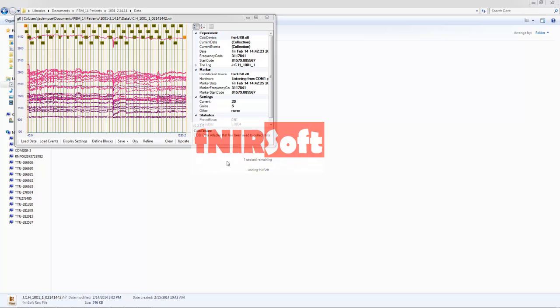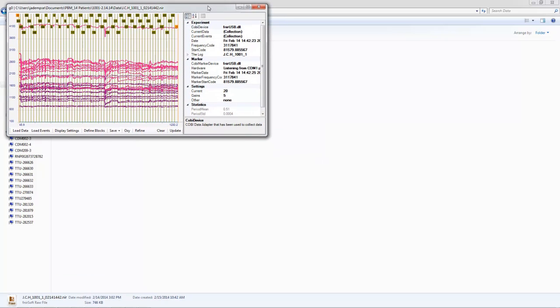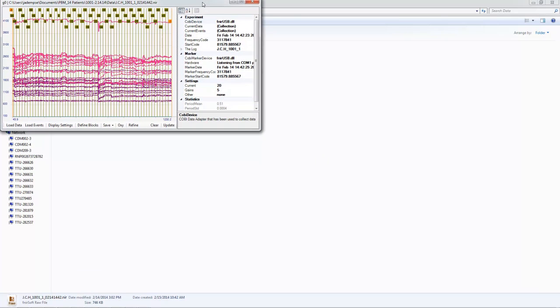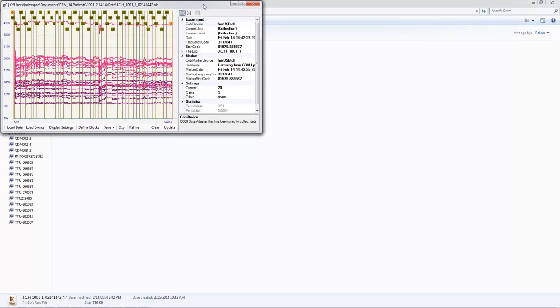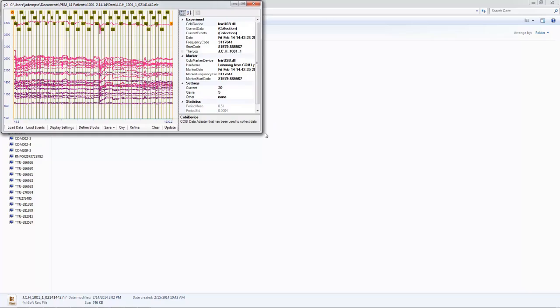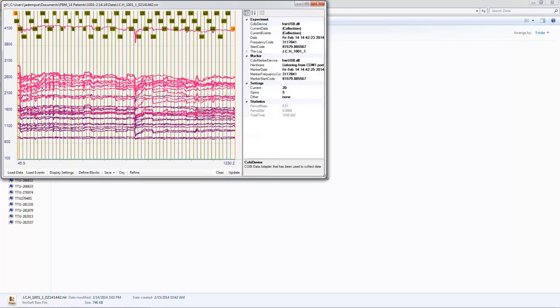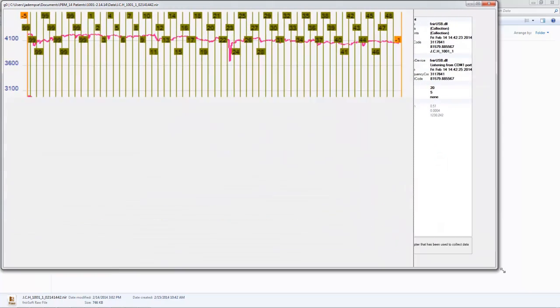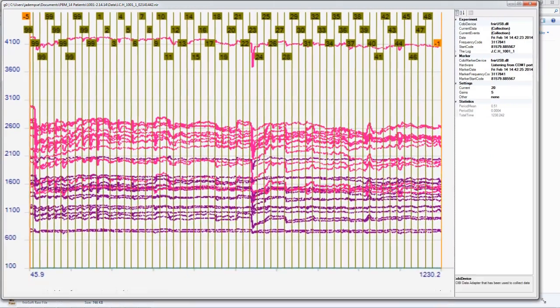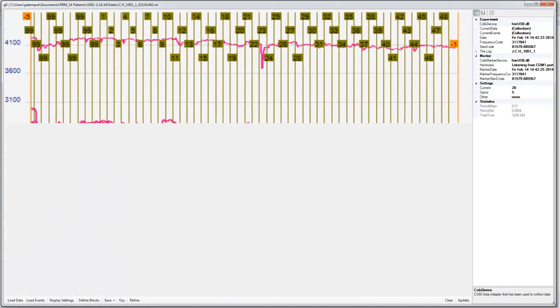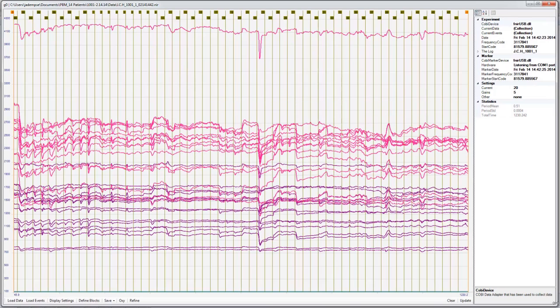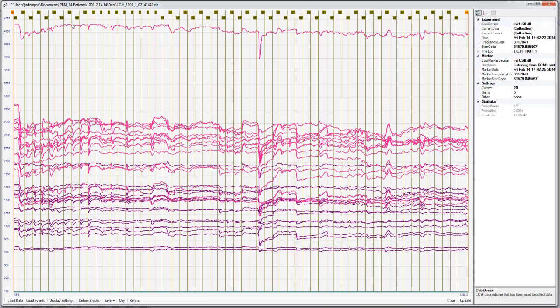Now the way I do this for our study is I actually label the habituation trials as 99 for the markers. Once you get to number 1 through 48, those are the experimental images. So now we have our first step here.